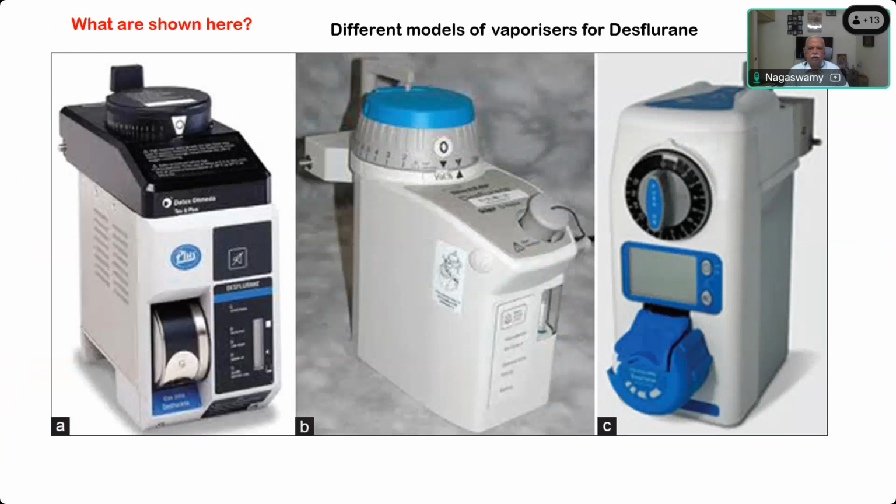These are different models of the desflurane vaporizer itself, by different companies. You can see there will be slight differences in the filling system: this is different, here it is different, here it is different. So small changes. This is Draeger, this is Tec 6, and Penlon.